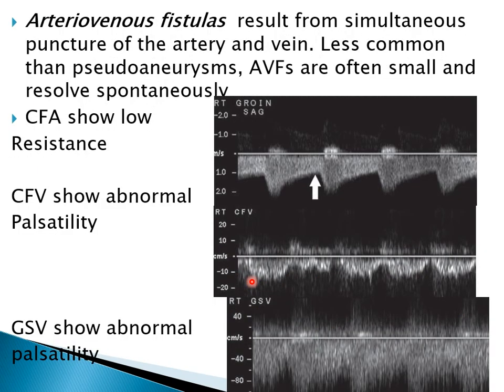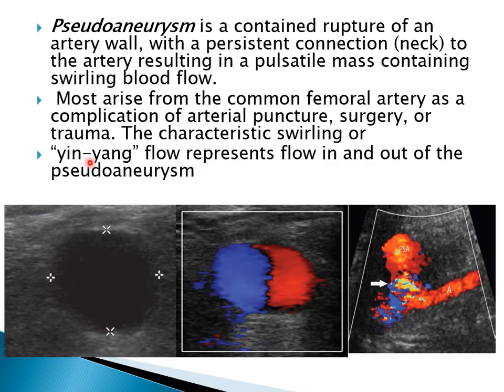Always mixed. You have AV fistula. This is the common femoral artery. Go back, please. Just one thing. When you see this appearance, especially if fresh, so in القسطرة مثلا 2, 3, 4 days ago, what you do, you identify the neck, you put the probe, you press really hard, for like 10-15 minutes. Sometimes it will thrombose and it will be cured. That's it. عالجنا خلاص. Sometimes, not always.